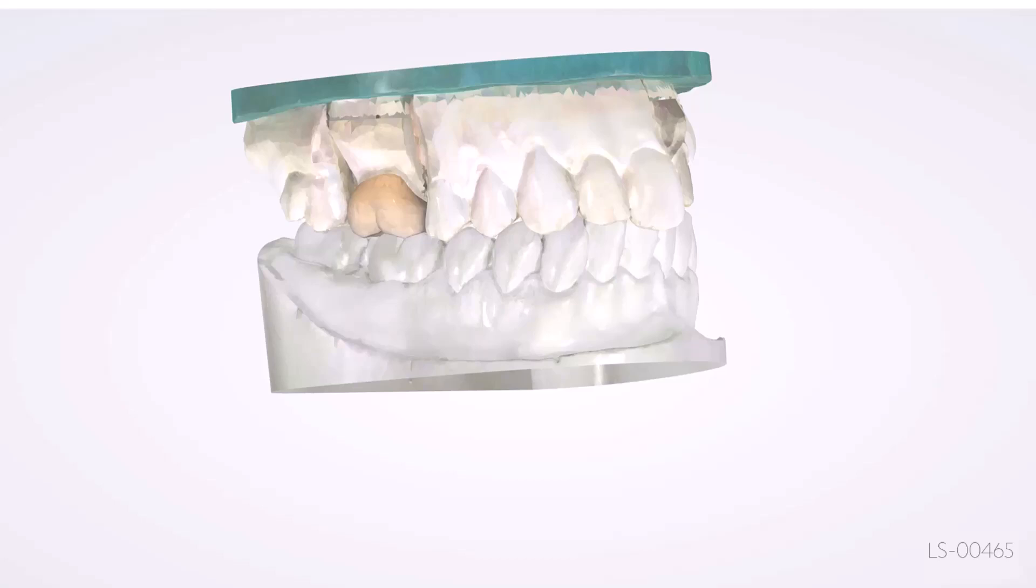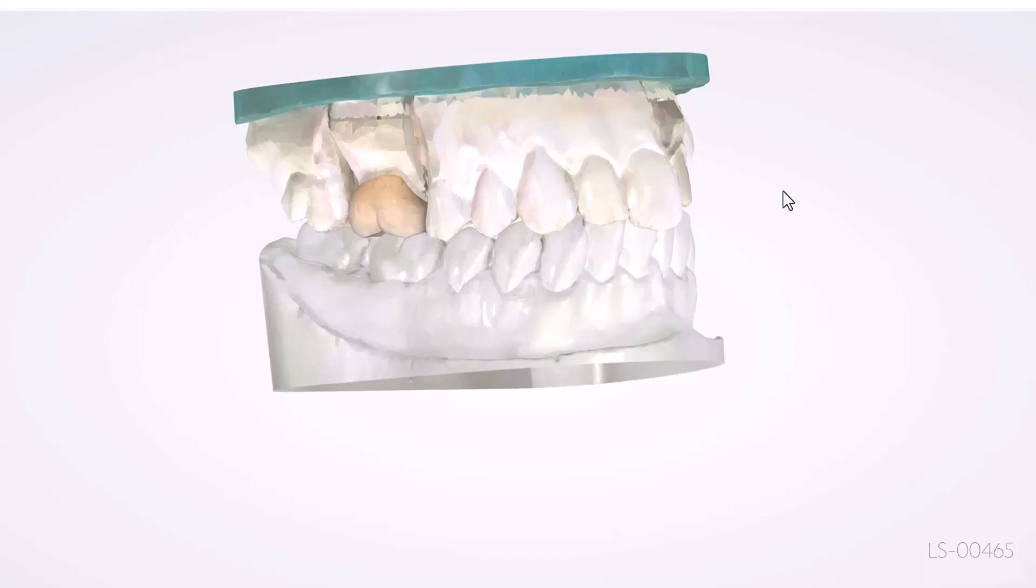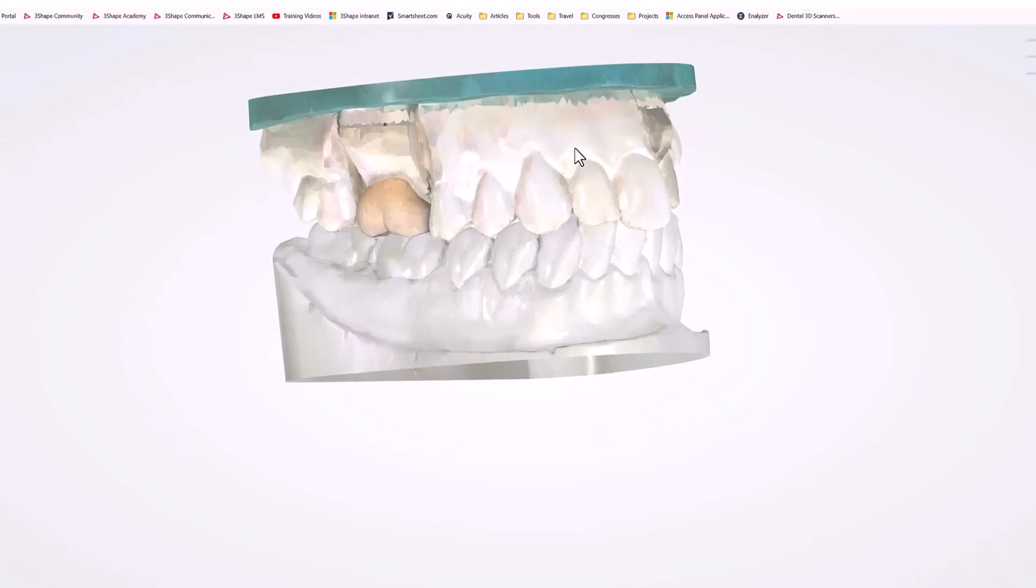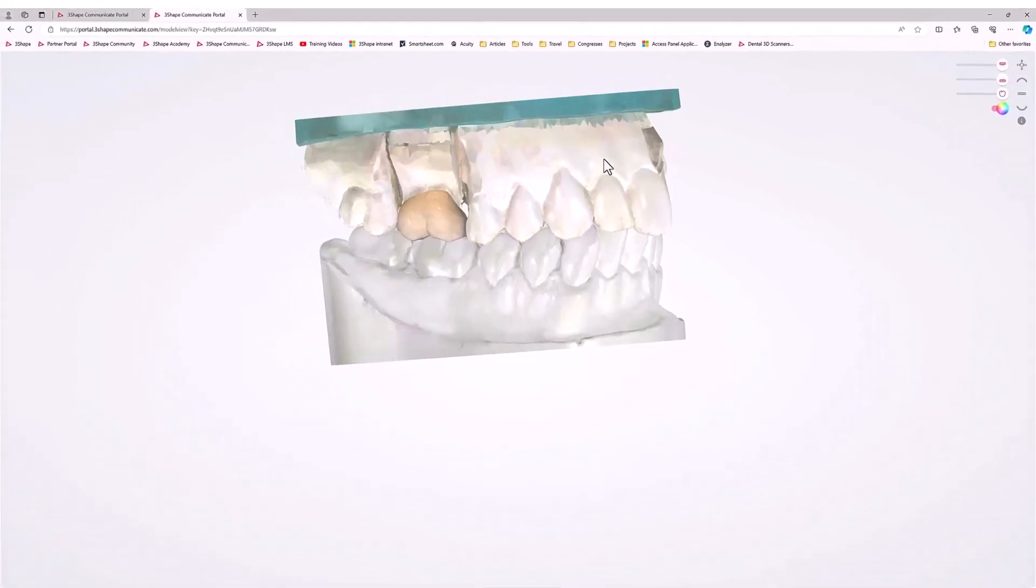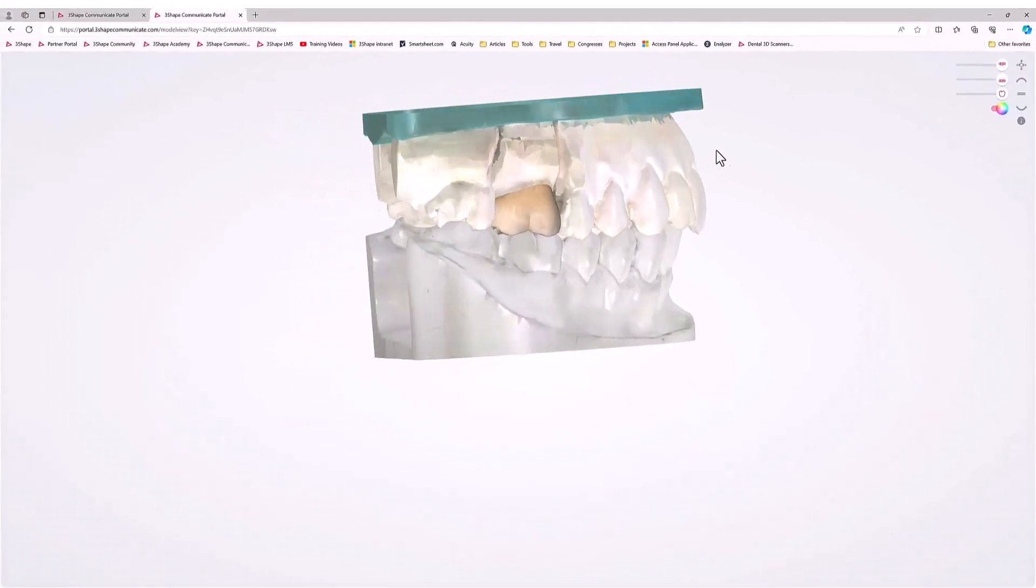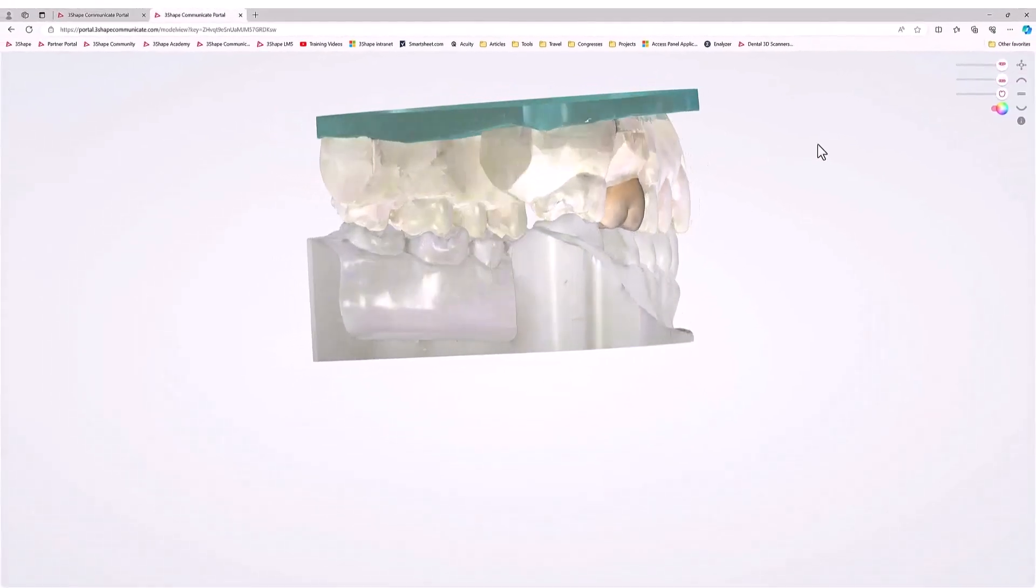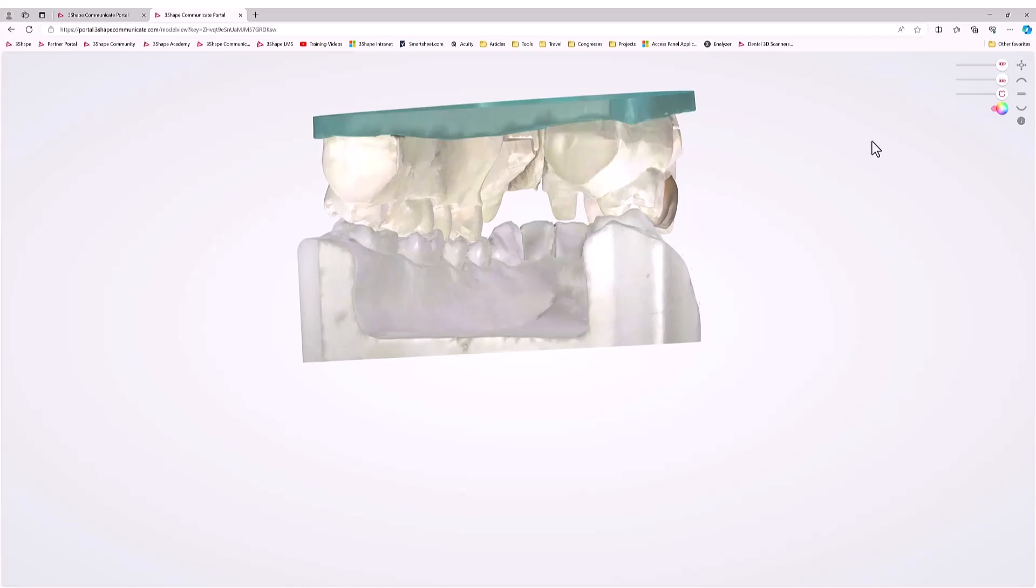Web Link Preview is a new feature available in Dental System that allows you to share a preview of a case in any internet browser without a 3Shape ID or access to 3Shape Communicate.